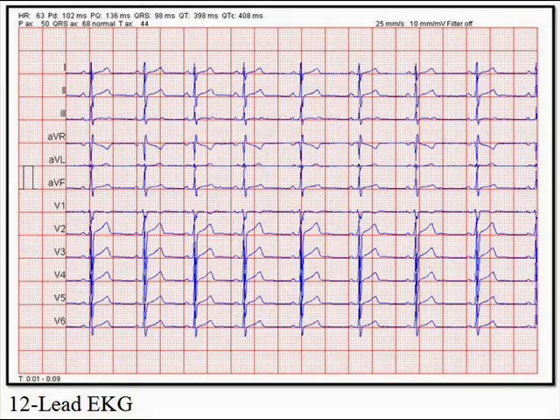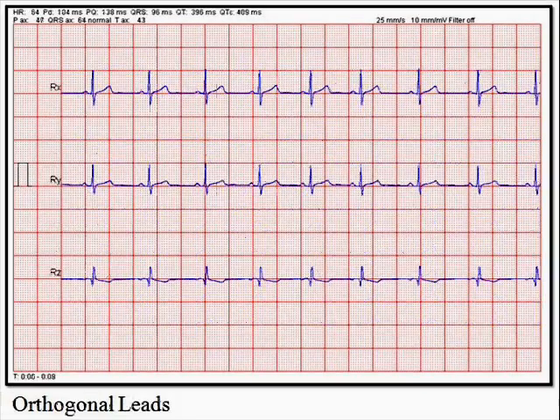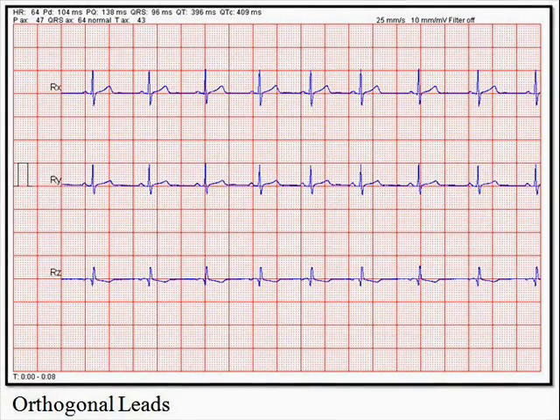I applied a regression to the 12 leads to get orthogonal images of the heart, and used this to obtain the components of the peak depolarization and repolarization vectors. The asymmetry deflects the vectors relative to each other, so I calculated the angle between them for a group of subjects with LVH and a group of athletes, and compared the results to traditional parameters used in clinics today.